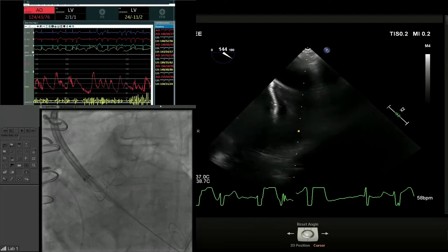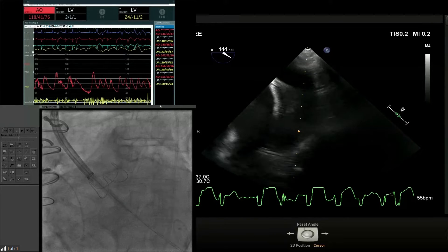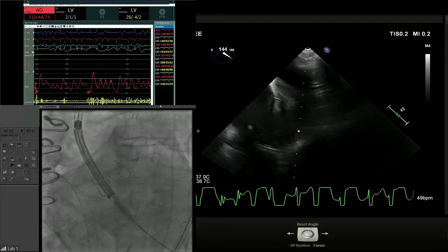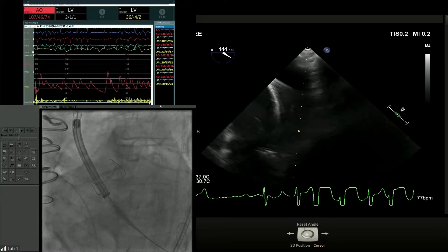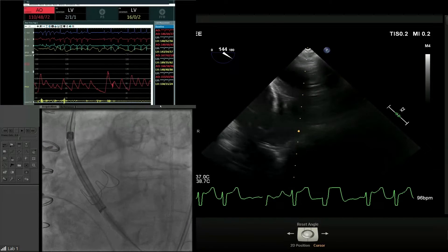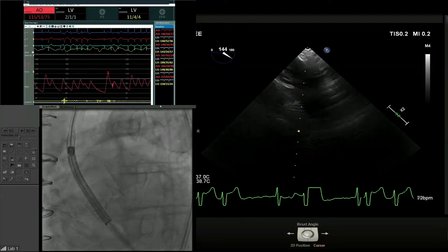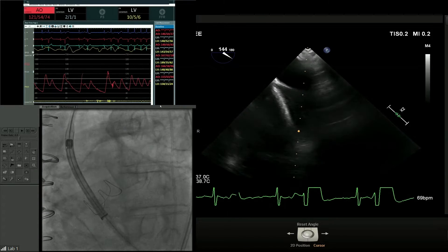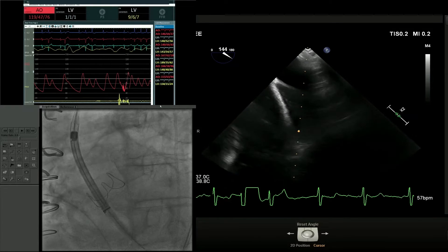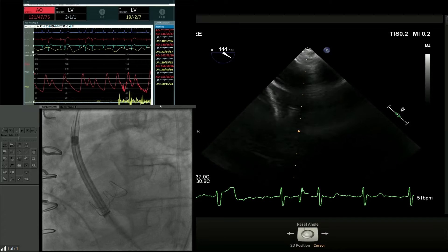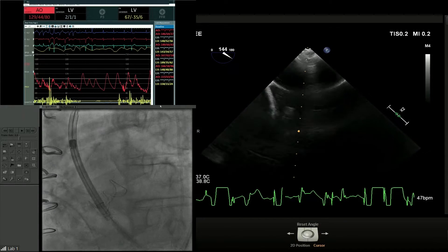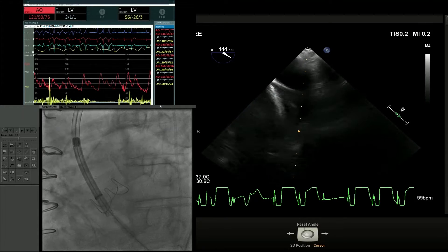Gilbert, why do you pace 180? You do not need to pace 180 to do this — it's an unnecessary stress on your patient. 120 is usually enough. Gilbert, remember: 180 makes you feel dead. 120 to 140 makes you feel like you're in love. Being in love is better than being dead. See how dynamic it is with 120? Do it more slowly, take your time.